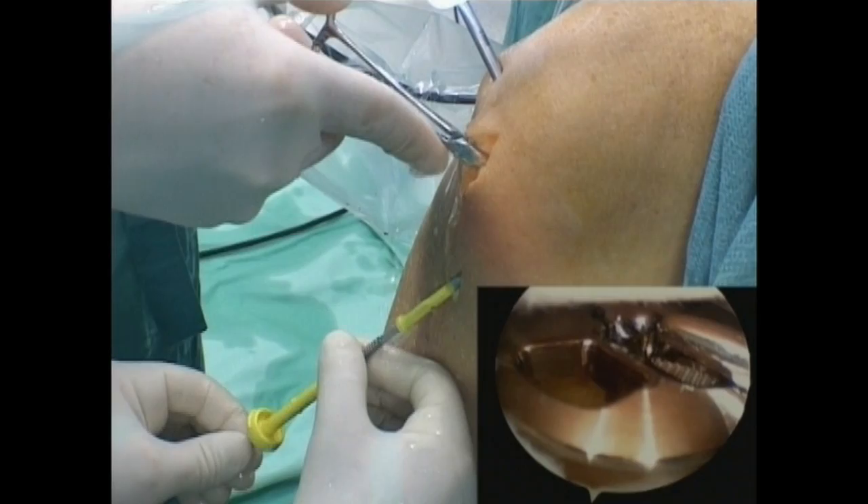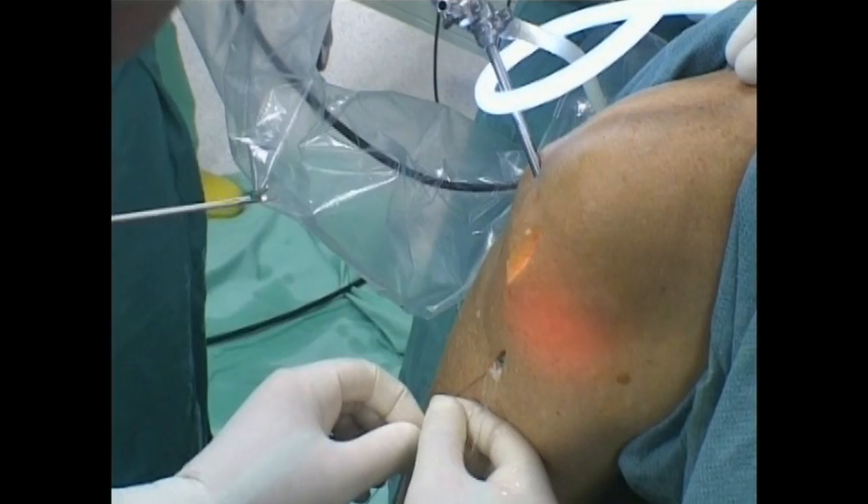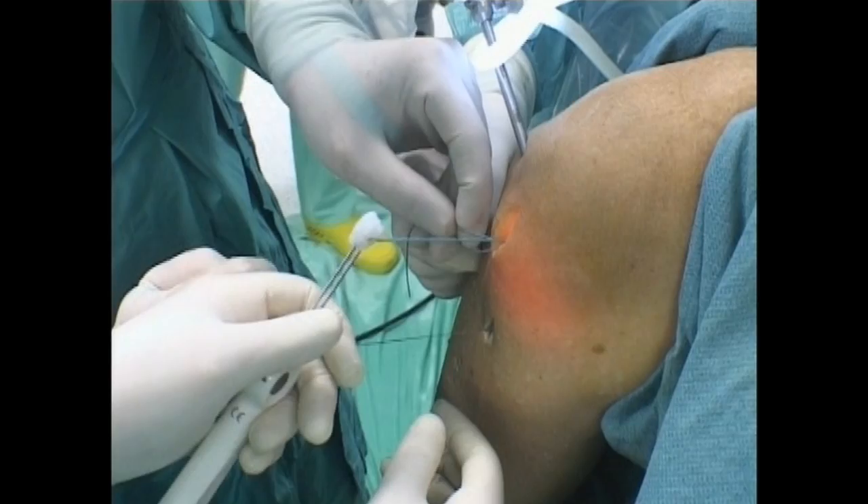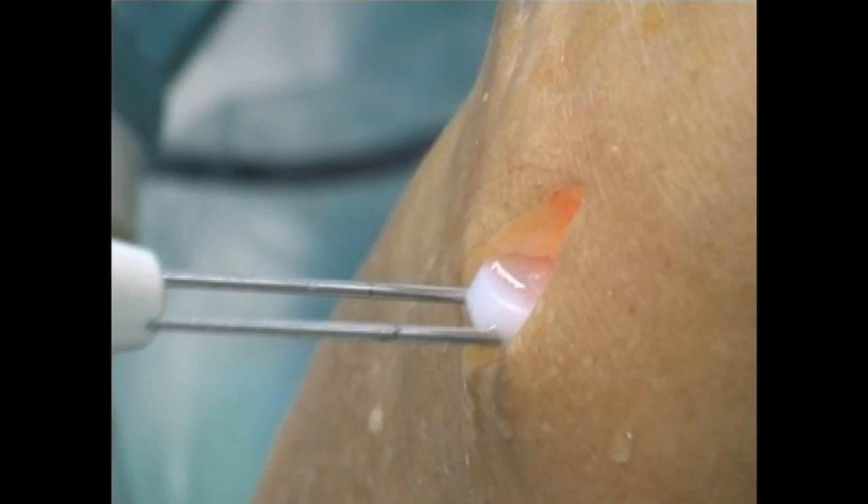The sizing trial, the drive shaft and cutting blade are removed. The suture retriever is inserted through the tibial tunnel. The definitive tibial component of the correct size is placed into the tibial socket using the delivery tool, the suture and the suture retriever. Pulling down the suture retriever, the sutures are grasped and the definitive implant is placed in its socket.